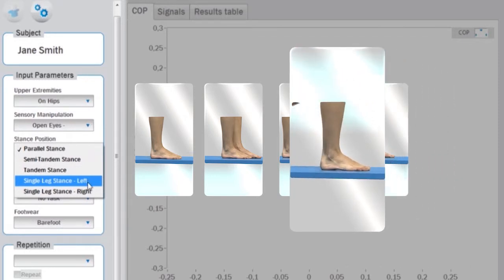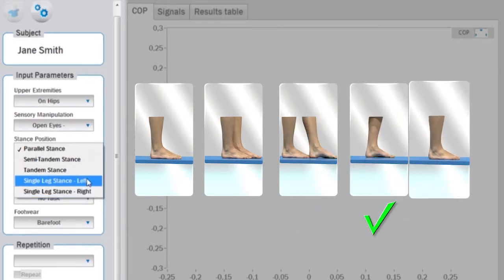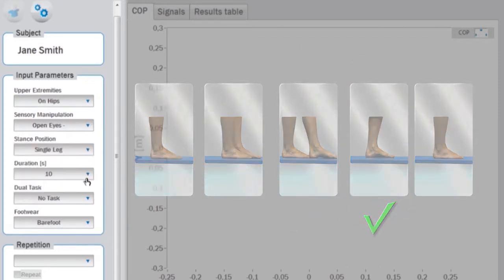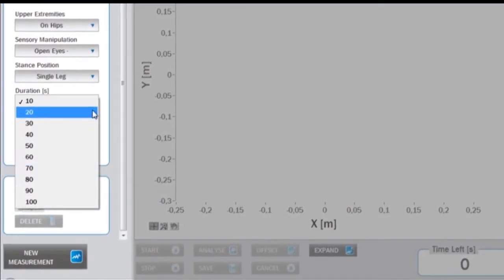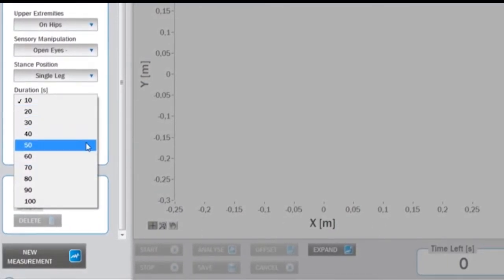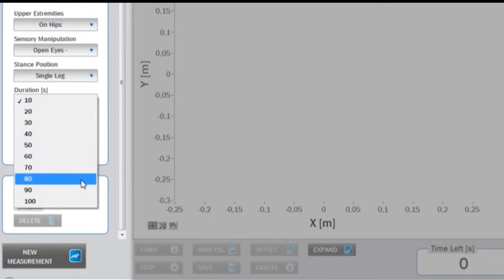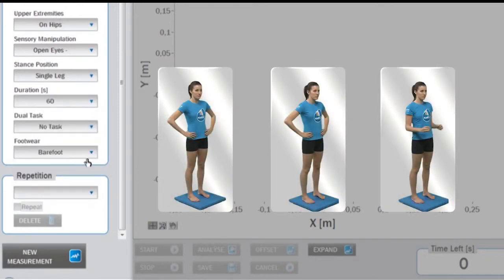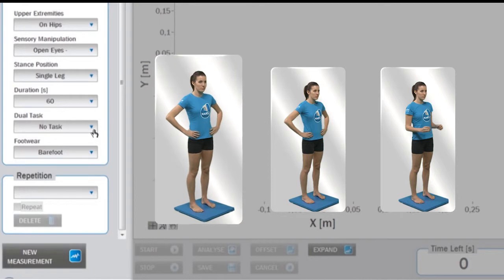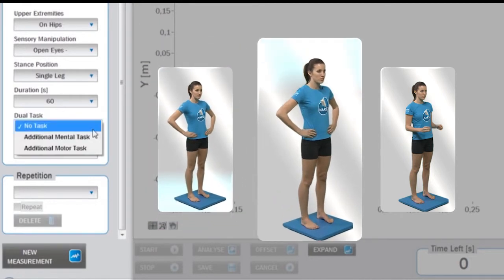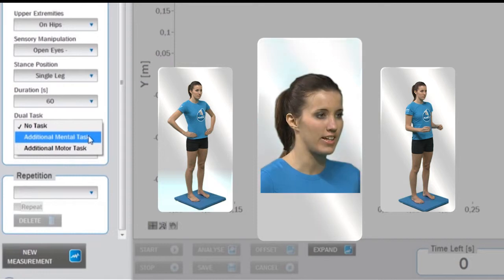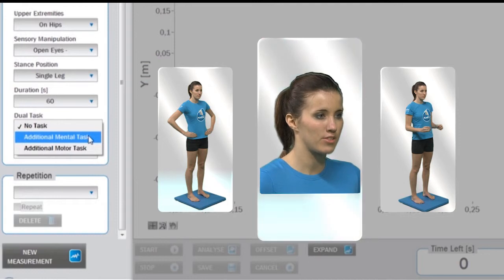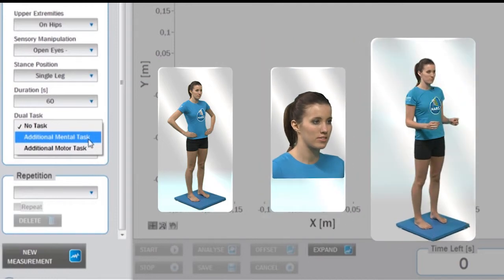Then determine the length of the task in seconds under the duration drop-down menu. For an additional task during measurement, you can choose among without an additional task, additional mental task (297, 294, 291, 288, 285), or additional motor task.